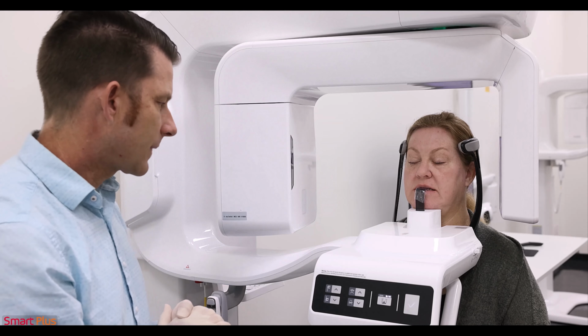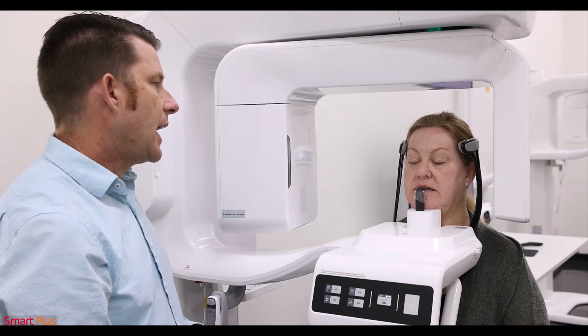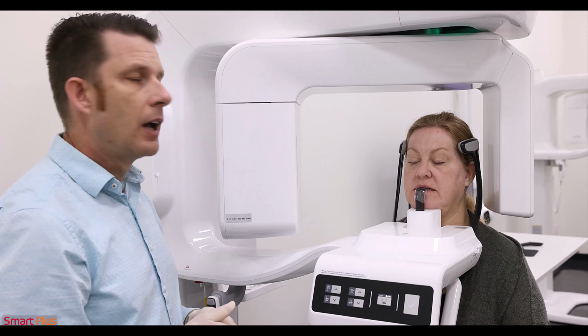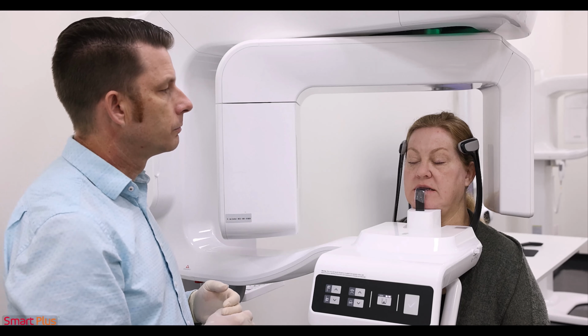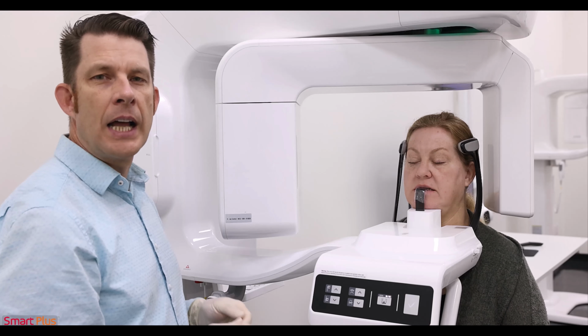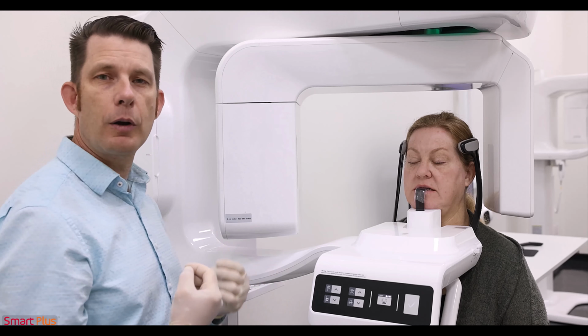Image capturing position. Please wait. The device will talk to the patient. And lastly, what it tells the patient is to have them close their eyes. I stay in the room until this is ready to capture. Please close your eyes until image capturing is complete. Next, I'm going to tell the patient I'm going to step out of the room, go ahead and relax, and we're going to go ahead and take our image.